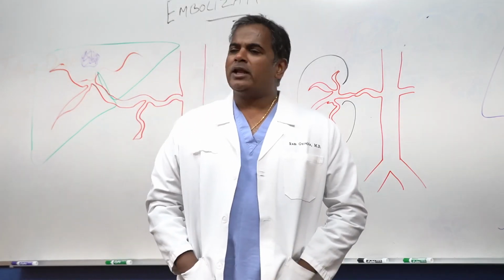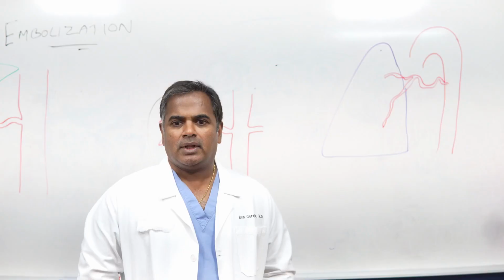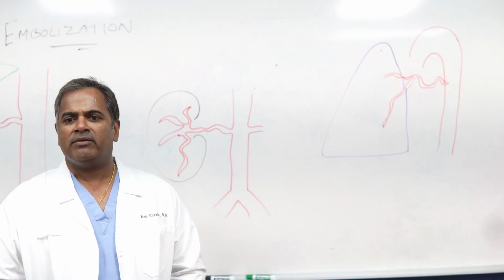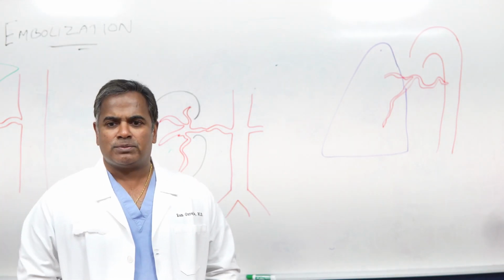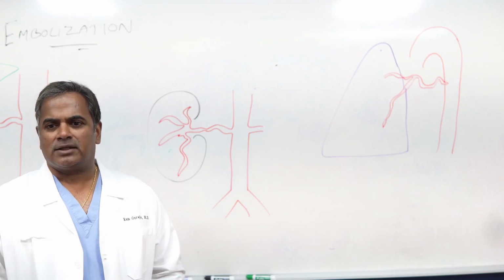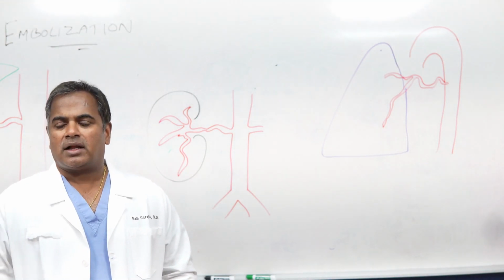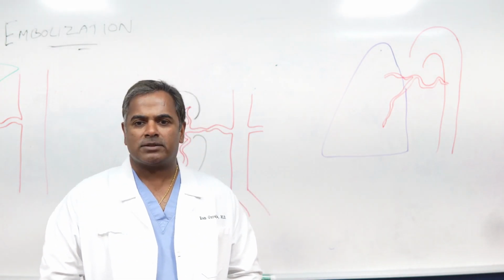What are the main benefits and applications for tumor embolization? Embolization has a number of benefits, such as relieving symptoms like heavy bleeding, decreasing the size of the tumors so that the surgeons can go back in and take the tumor out, reducing the loss of blood during surgery to remove a tumor, and, not the least, slowing the tumor growth when surgery or chemotherapy are not possible.